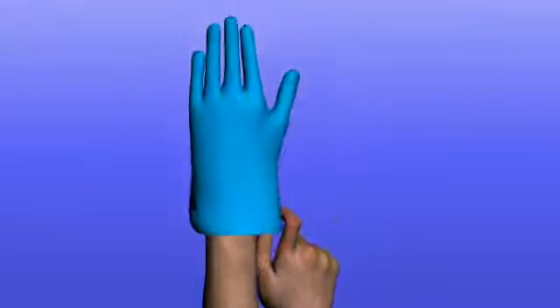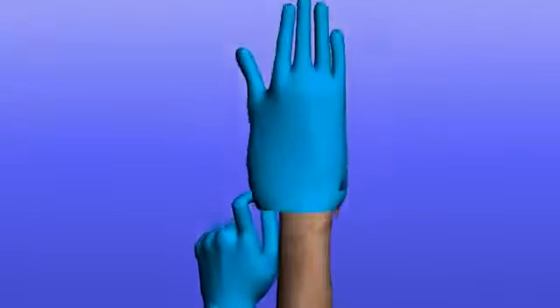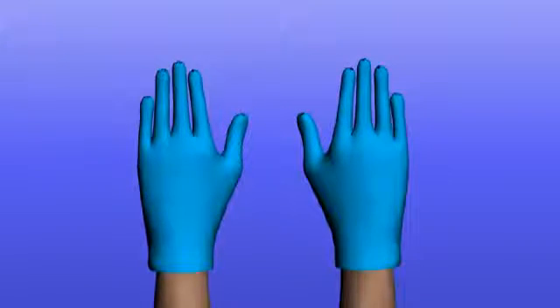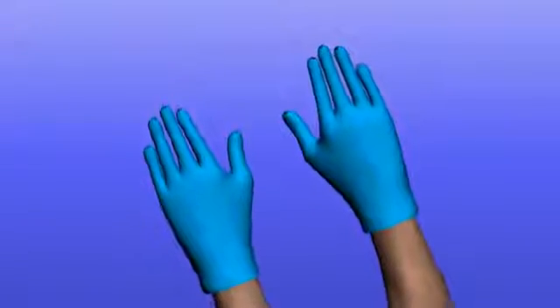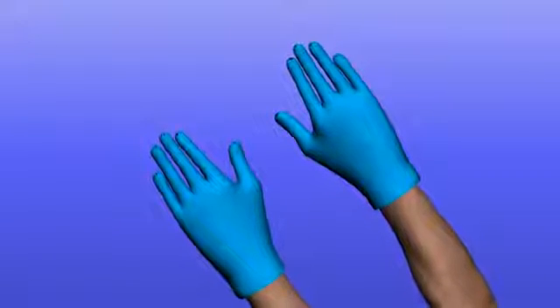Pick up one glove by the wrist and put it on. Pick up the other glove by the wrist and put it on the other hand. Both gloves fit either hand. Be careful not to let the outside of the gloves come in contact with anything non-sterile, for example clothing or skin. The outside of the gloves needs to remain sterile.